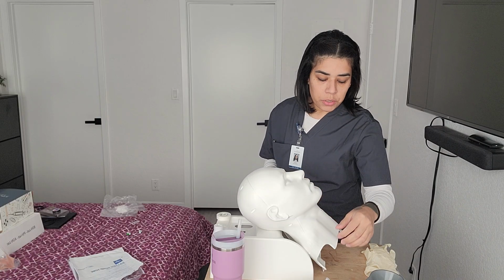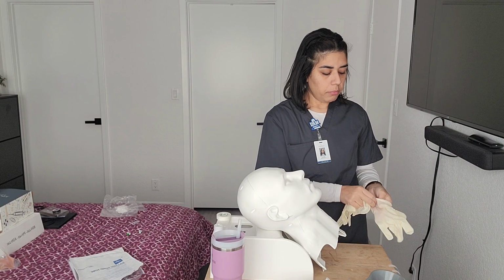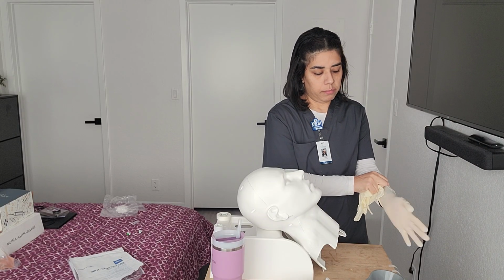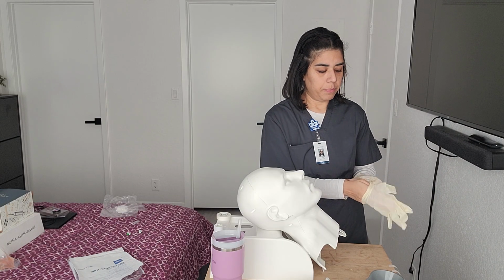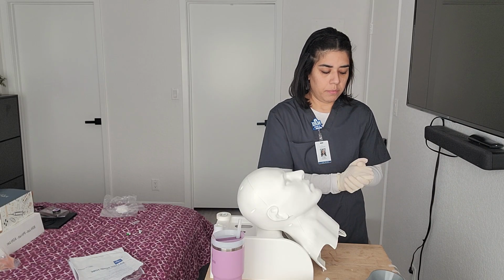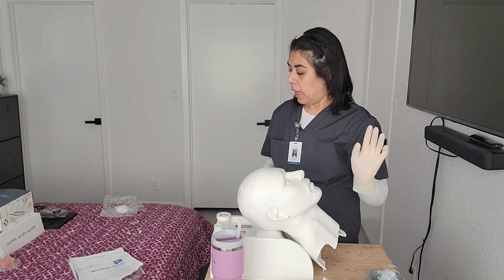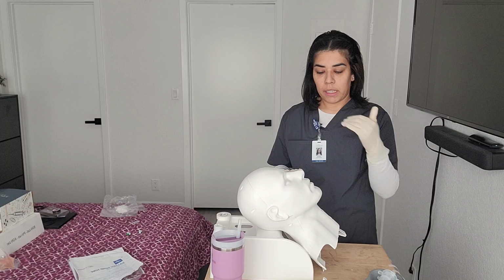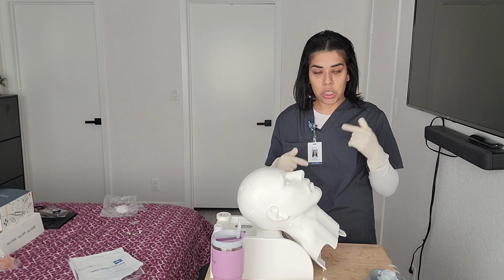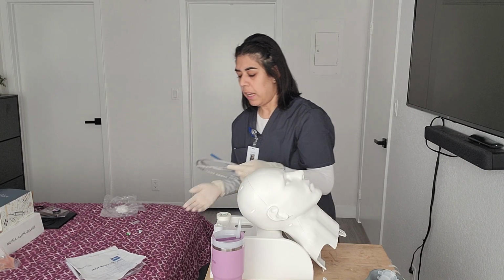All right, Mr. Manny, we're gonna go ahead and put our gloves on. We've already performed hand hygiene. Okay, Mr. Manny, before we give you the napkin, I'm gonna measure the NG tube to see how far down we have to go.